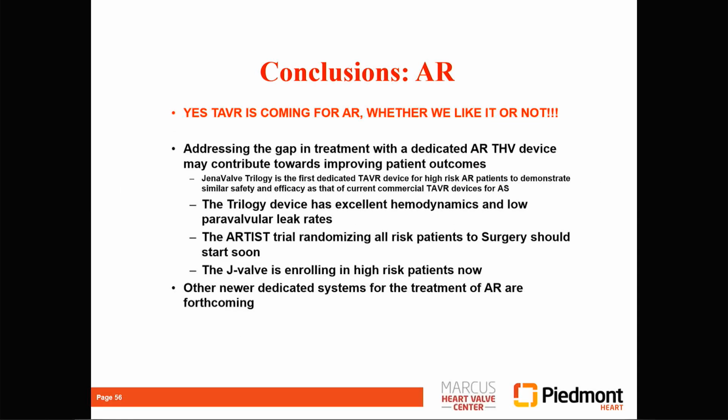So in conclusion, yes, TAVR is coming for AR. Whether you like it or not, it is there. It's coming. For the surgeons in the group, it's here. I've done a lot of these, and it works very well. If we can figure out the pacemaker rate, it is the holy grail. We have to address the gap in treatment for this.